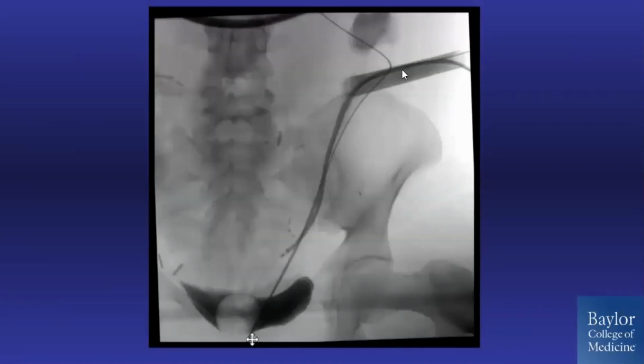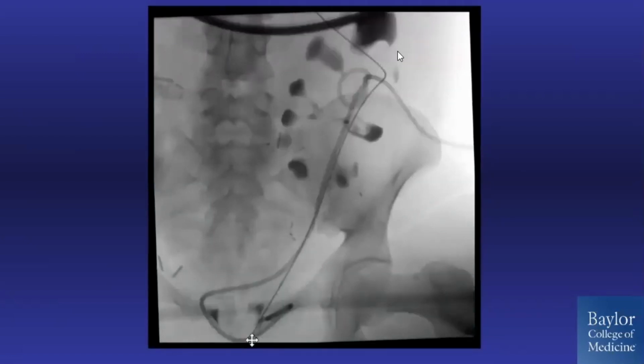You can do anterograde ureteroscopy to clear the system. And ultimately, we like to manage these patients with a nephroureteral stent. Of course, in native systems, I don't leave percutaneous tubes after PCNLs. But in the transplant patients, I think it makes good sense. So there's just a flavor of some of the more complex cases that can come.